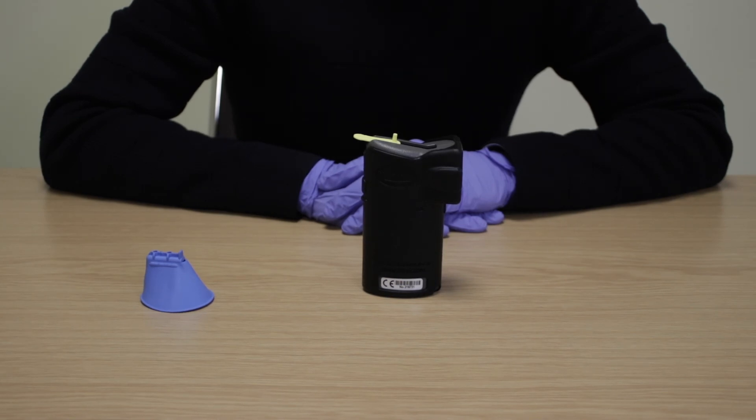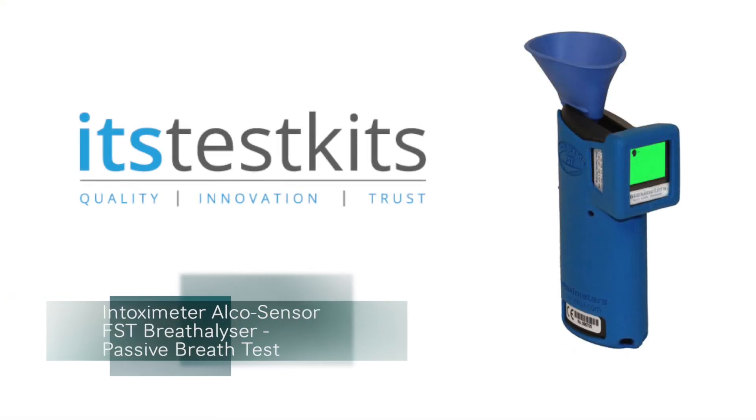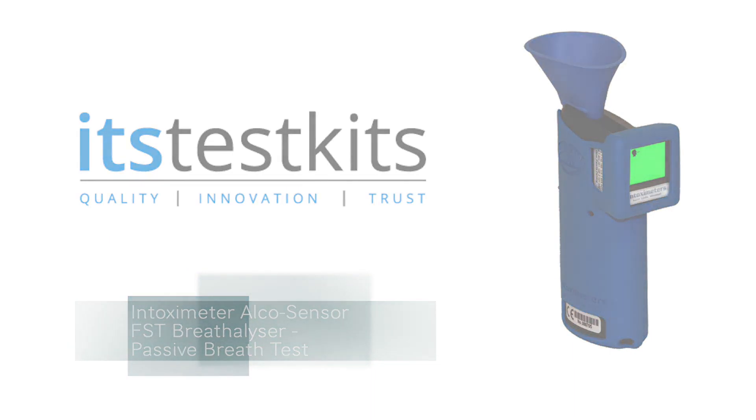Any positive sample would need to be sent to a lab for confirmation. To repeat a passive test with another container, press the on button and repeat. This concludes passive testing on the Intoximeter AlkaSensor FST Breathalyser product and user guide.